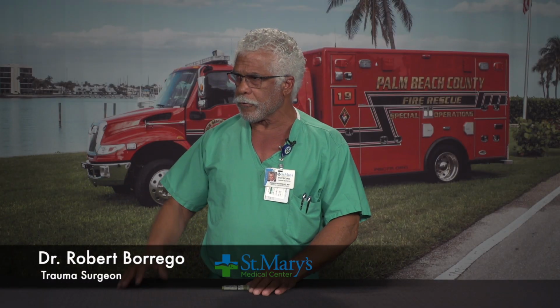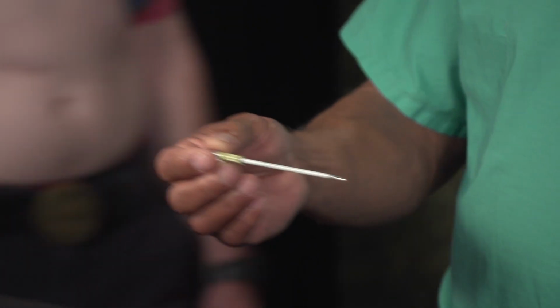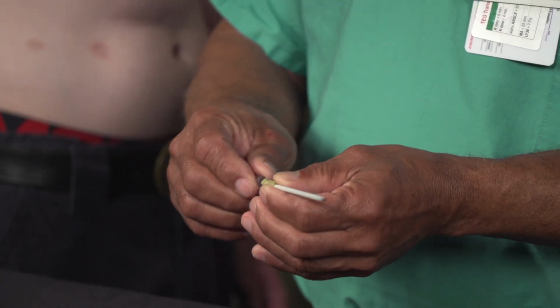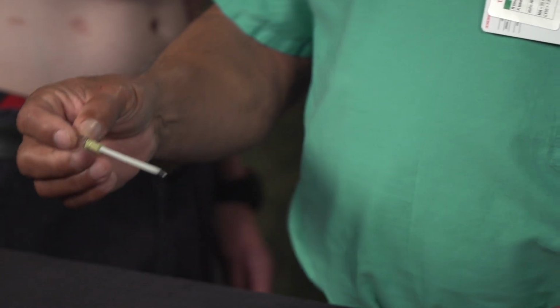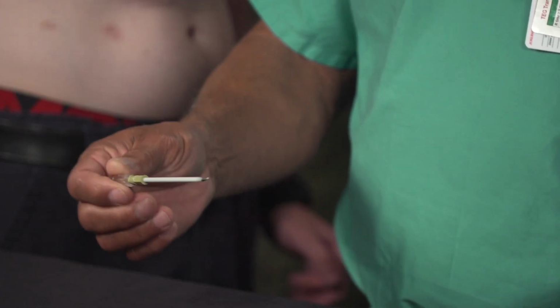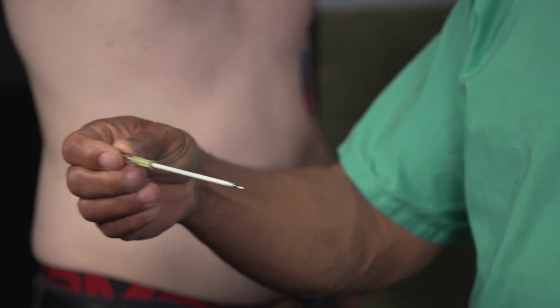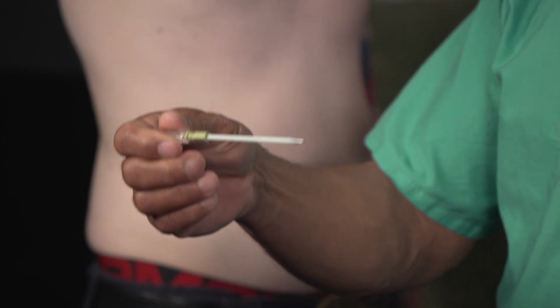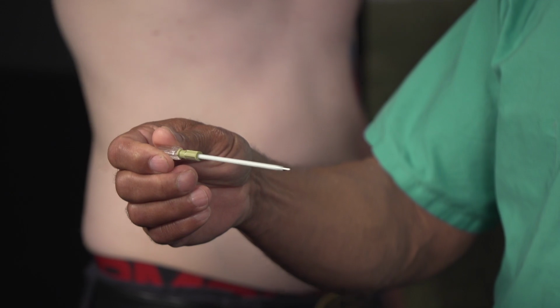And if maybe the student could come out and show this. This is a 10-gauge needle with a catheter, obviously. And it's a good size. It's what, like 3 inches? Yes, 3 inches long. So you can see that even in a newborn, this will penetrate very deeply. And that's why you want to make sure that you have the right diagnosis. Because if you don't have the right diagnosis and the mediastinum has shifted to that side, then it's very easy to hit the lung or hit any other structure.